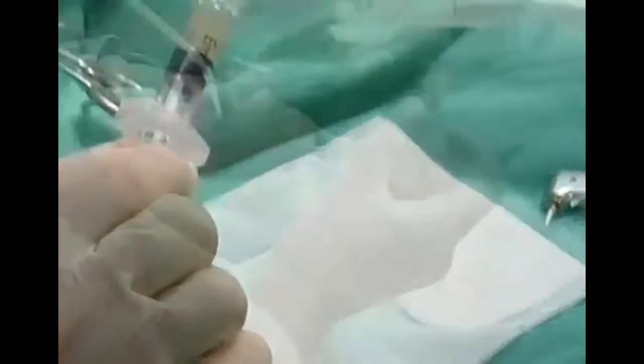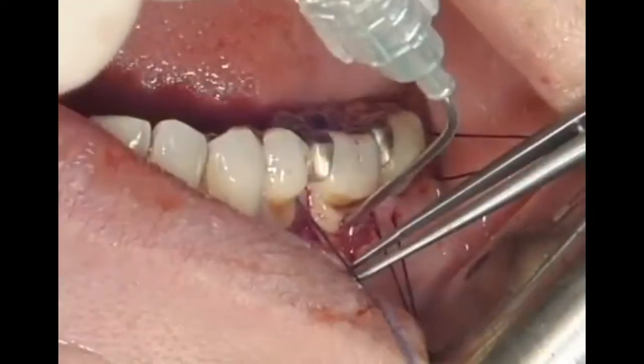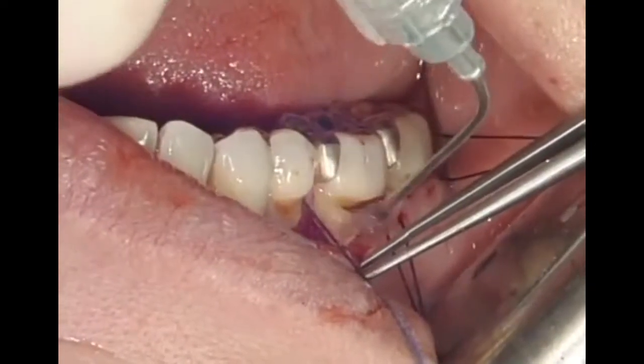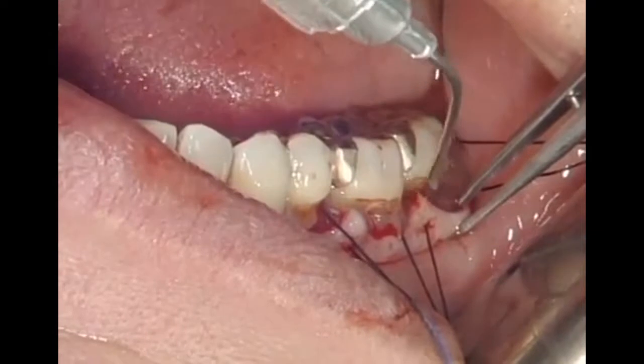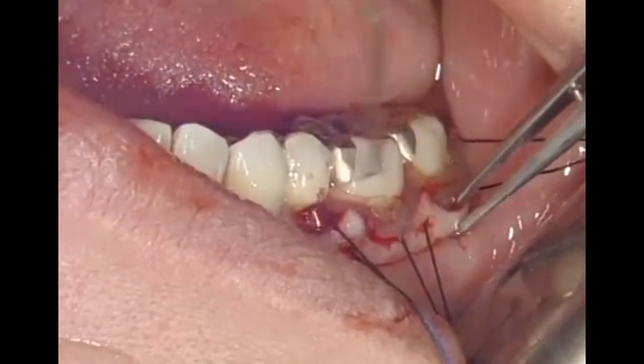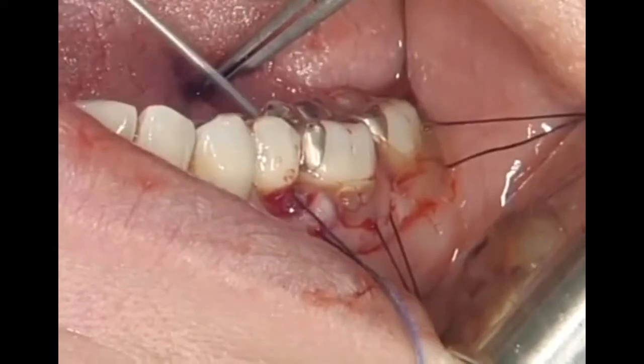Emdogain comes as a ready-to-use gel in a syringe. It is applied immediately after rinsing to the root surface, starting at the most apical bone level. It is important to fully cover the root surface with Emdogain.